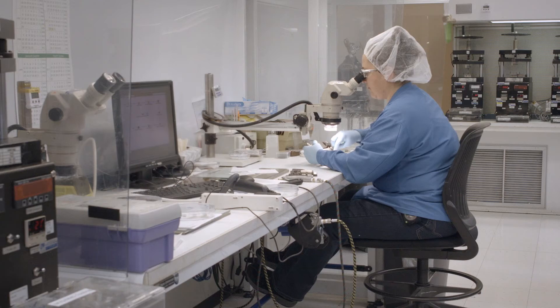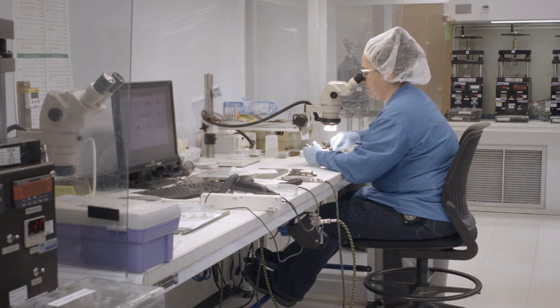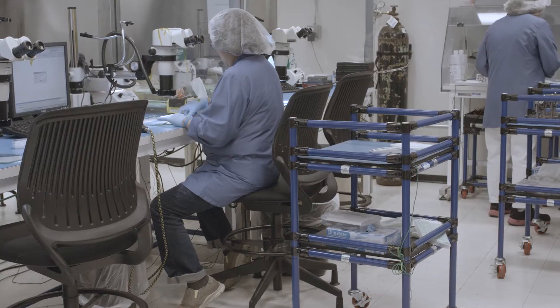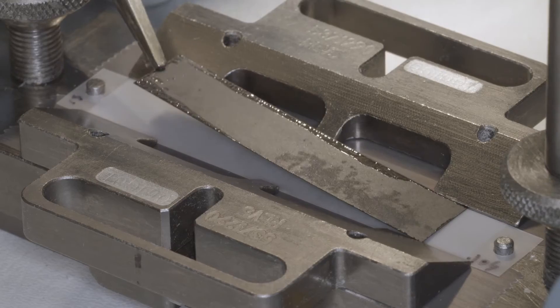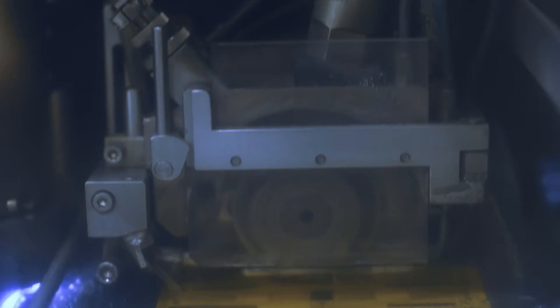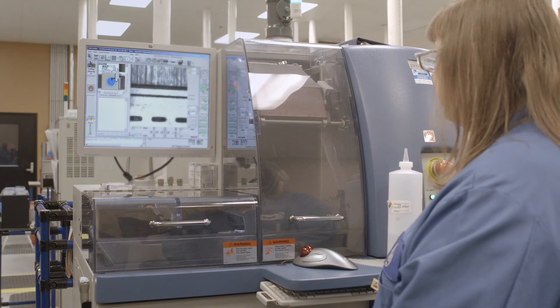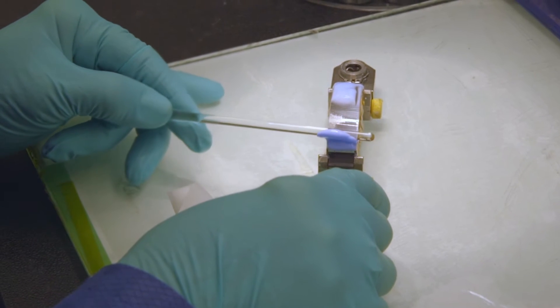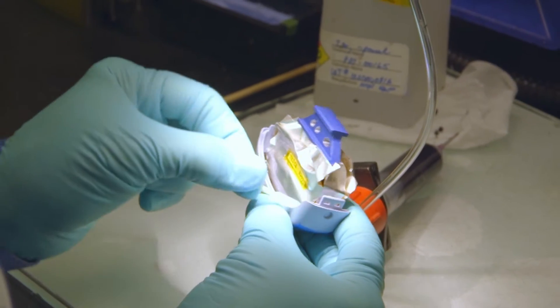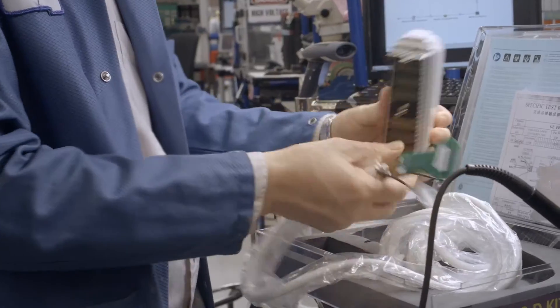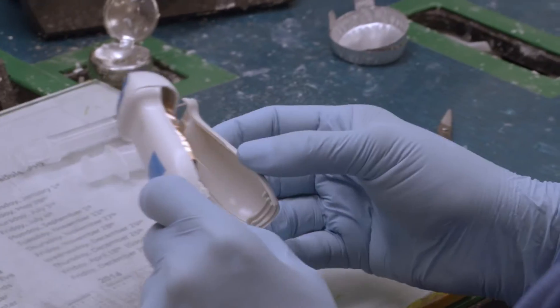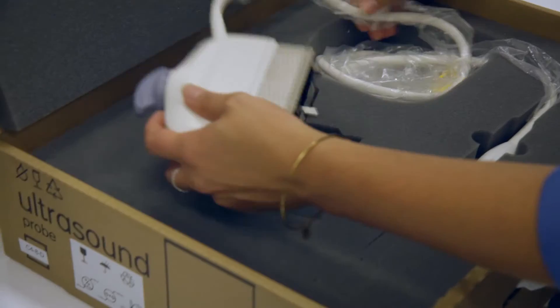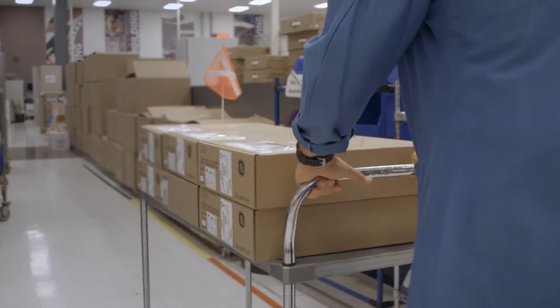The manufacturing process of a transducer really starts at lamination, where we are applying the individual layers to build the acoustic stack. You move that into a dicing operation. After that, we go through a bending and bonding phase, a nosepiece install, lensing operation. We will assemble that transducer into a probe, and that will then become your finished medical device.